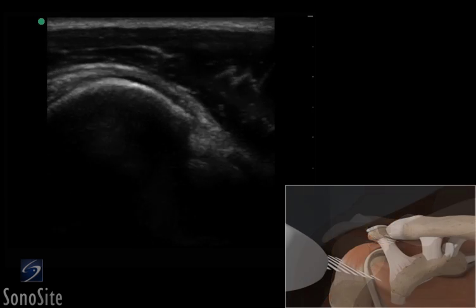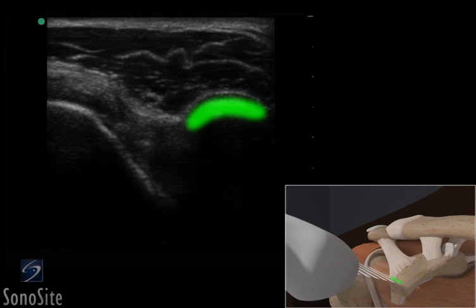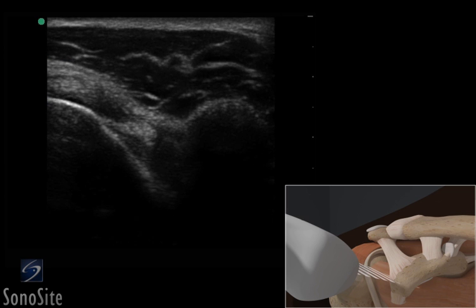The transducer is then moved slowly medially until the bright hyperechoic coracoid process can be seen. The biceps tendon will come into view in the mid portion of the screen as a bright, hyperechoic circular structure with the subscapularis tendon to the right and the supraspinatus tendon on the left of the image to complete the evaluation.